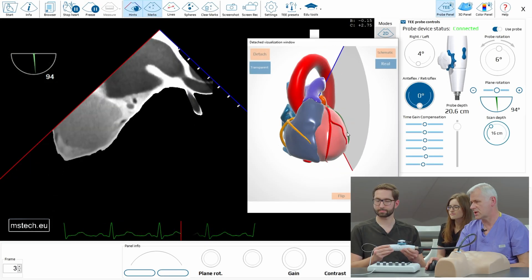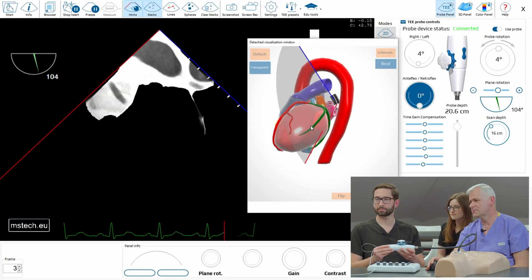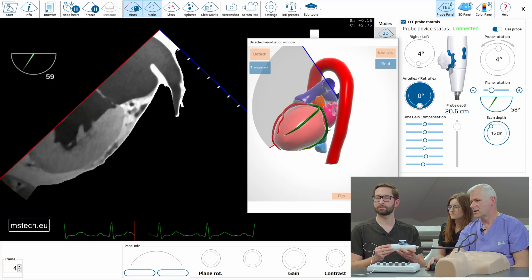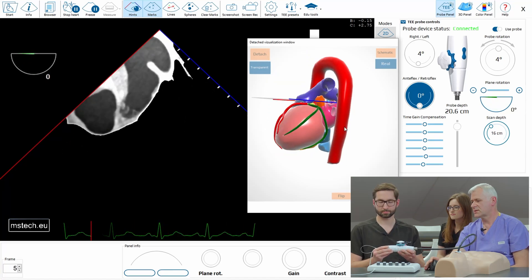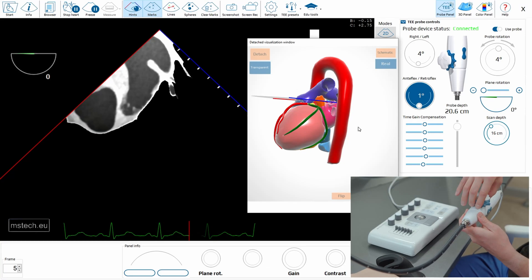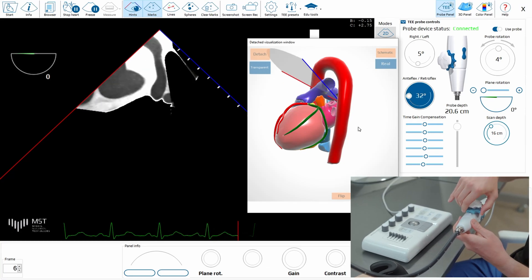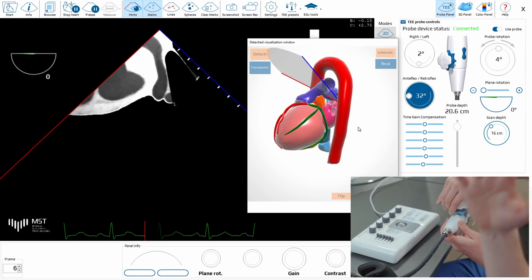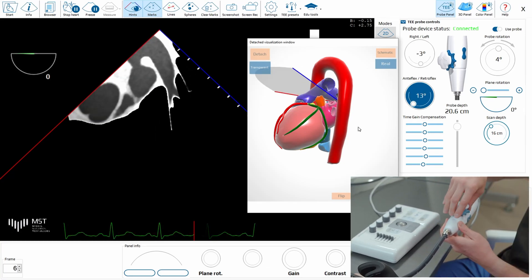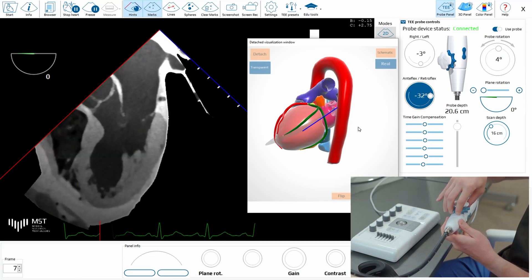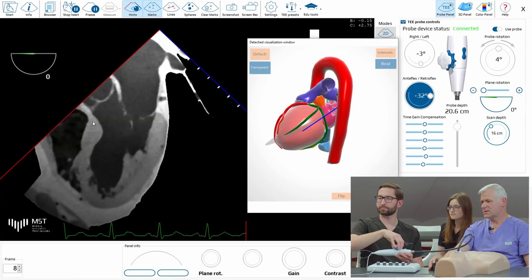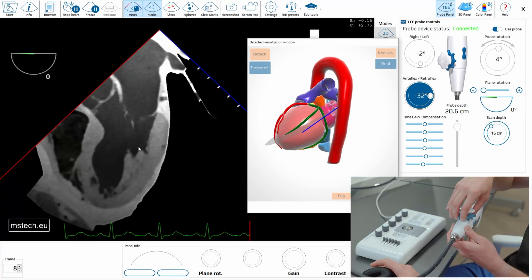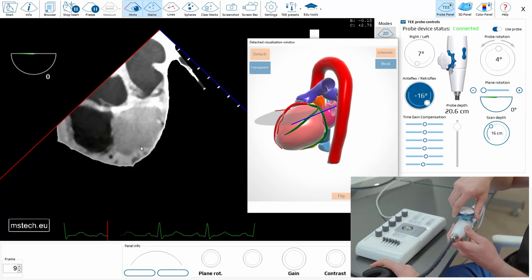Come back to zero and now try to do anteflexion. Anteflexion means the big knob clockwise — the plane is going up. If you do retroflexion, it's going down. And you immediately see the difference in the images that you can see here. So do anteflexion once again.